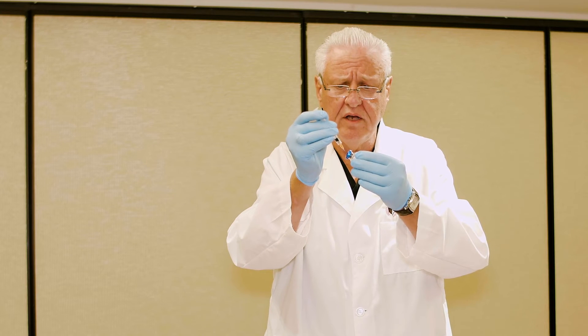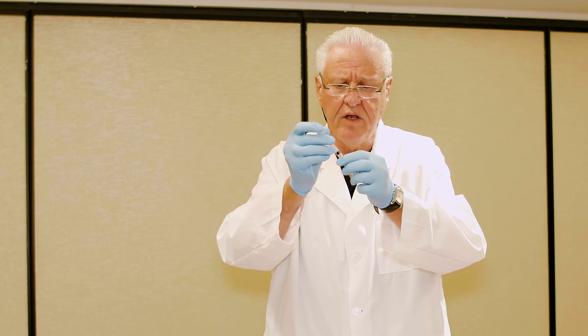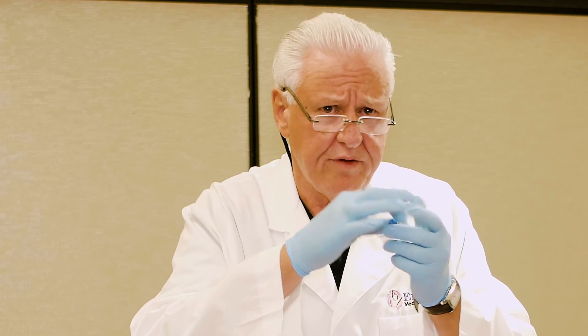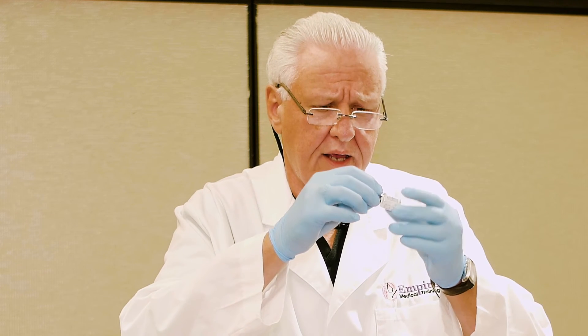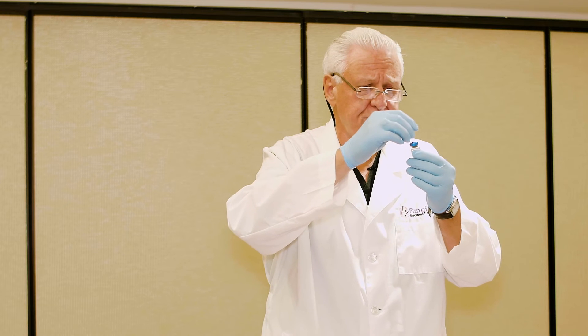After the plunger finishes and touches the bottom of the syringe, you want to remove the syringe from the needle. Then grab the vial and the needle at a 90-degree angle and rotate it to make sure all of the product gets mixed with the dilution solution.